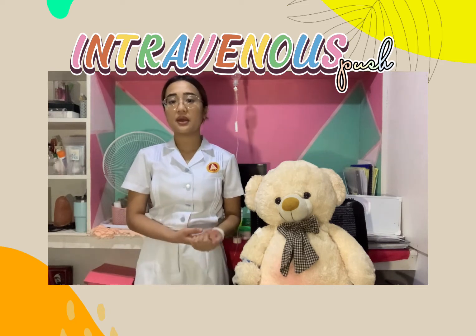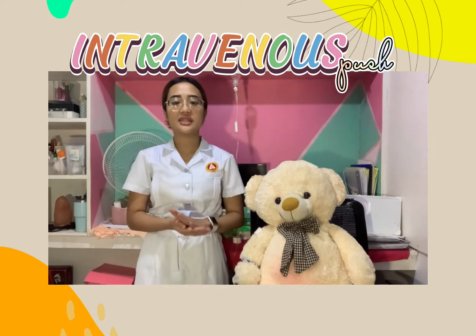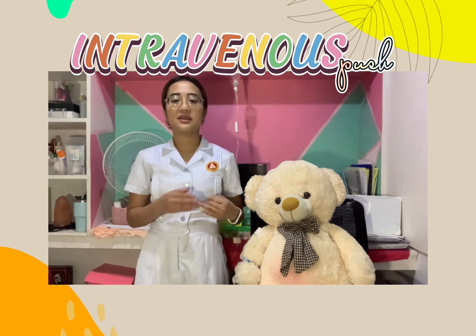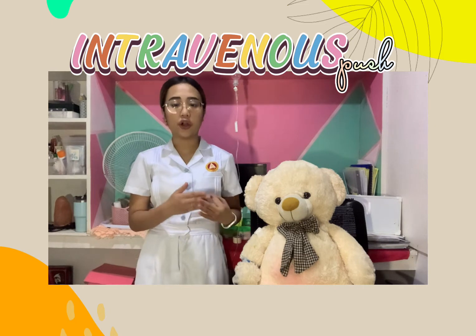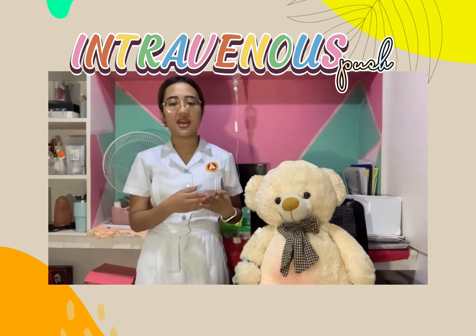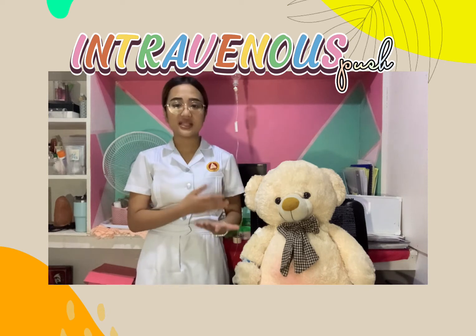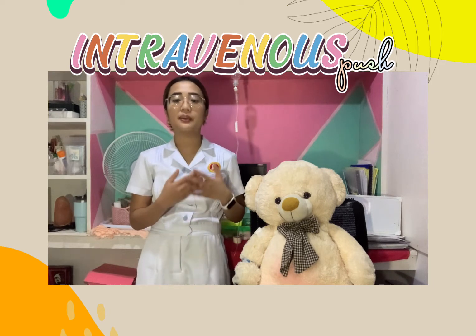For the assessment, we will assess our patient. We will assess the appearance of the selected site. We will assess the specific drug action and the expected outcome of the medication ordered. We will assess our patient's knowledge and understanding of the ordered medication. We will assess our patient's vital signs, most especially when the medication ordered is potent.